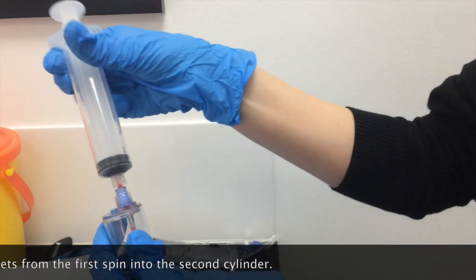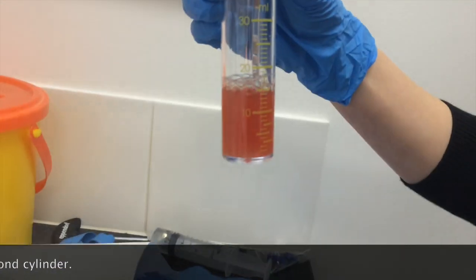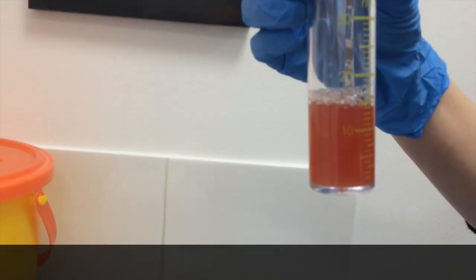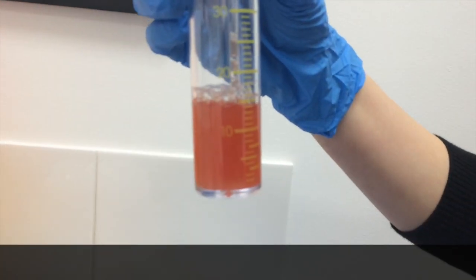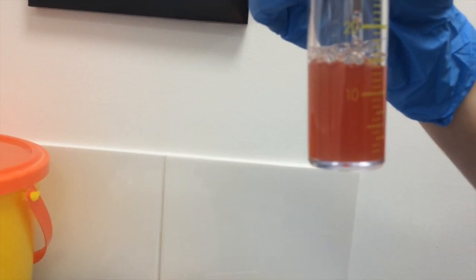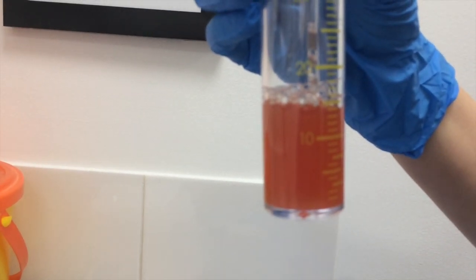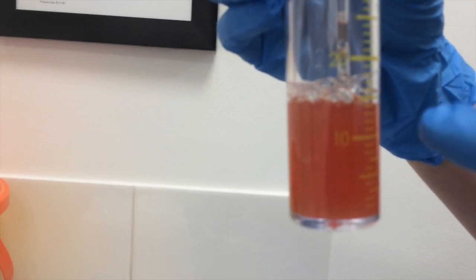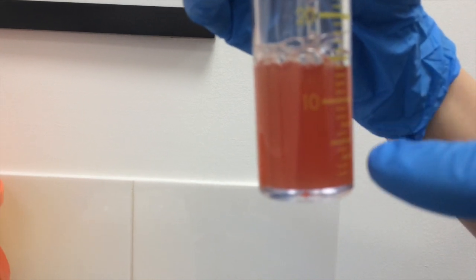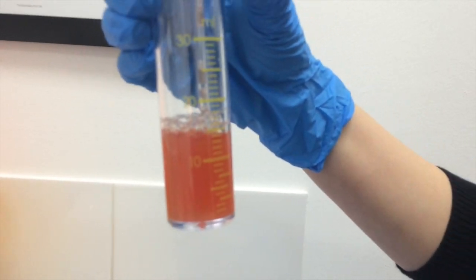Just inject that right in there. Okay, let's take a look at that. The reason it's pink is because there's some red blood cells in there, which is fine. It's cloudy because all the platelets are kind of floating around, along with some white cells — they're all floating around in this serum.